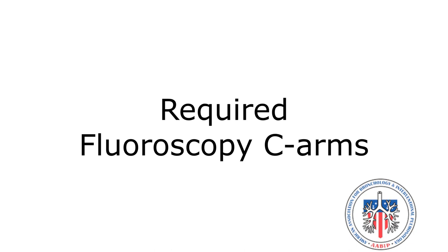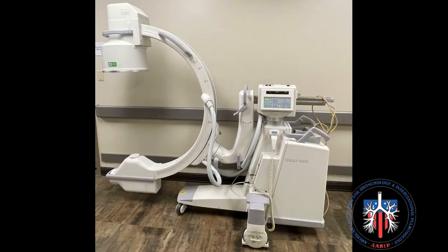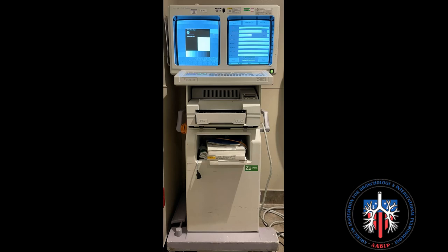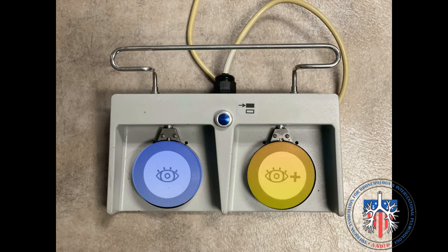Required fluoroscopy C-arms: the GE 9800, 9900, and Phillips Pulsera 12-inch are the only compatible C-arms to perform digital tomosynthesis with the Lumisight. This is a GE 9800 C-arm and its corresponding monitor. These are the C-arm foot pedals. The pedal shaded blue is standard fluoroscopy, and the yellow shaded foot pedal is high intensity fluoroscopy used for digital tomosynthesis.